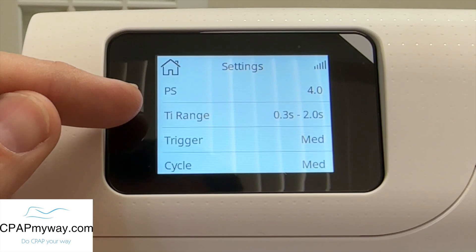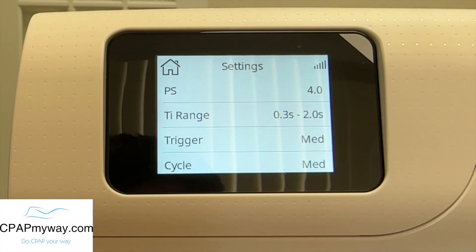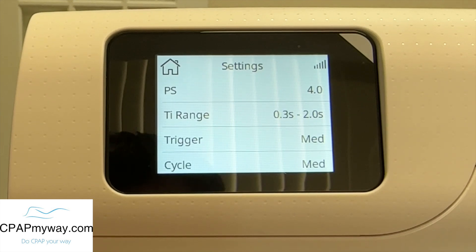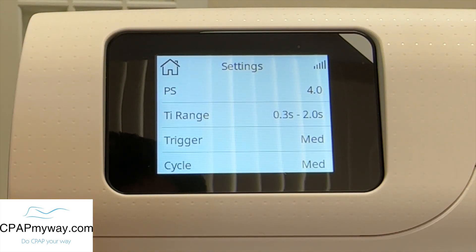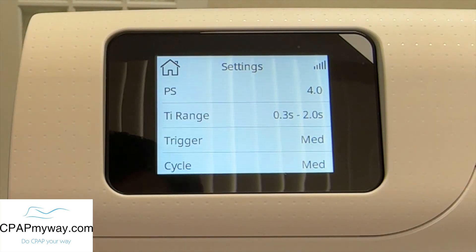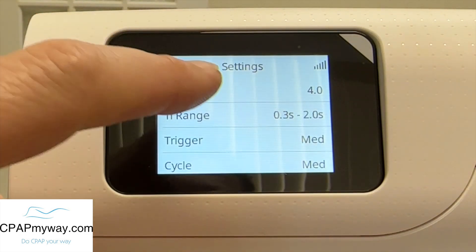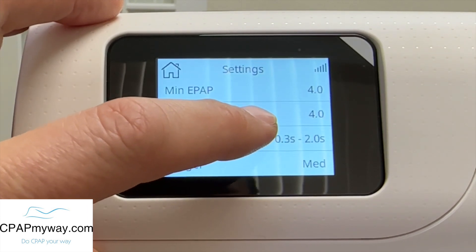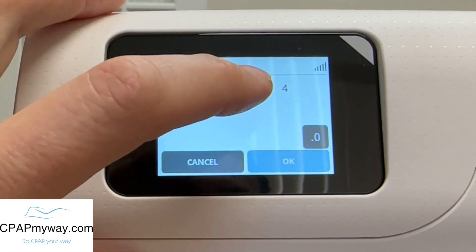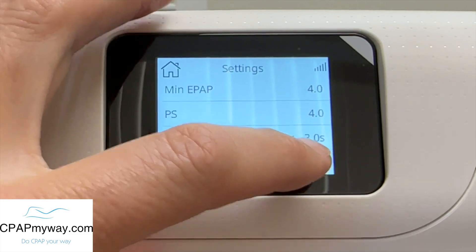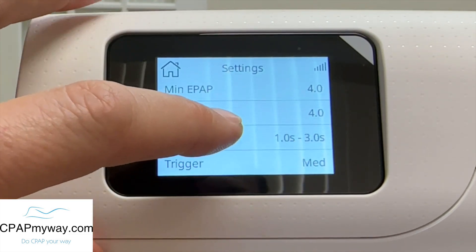The next thing you're going to see here is TI range. TI range is the range of inspiratory time limits to accommodate individual respiratory conditions. The TI max would limit the inspiration time for patients who require a longer expiration time. And the TI minimum prevents the premature cycling to EPAP for patients whose inspiratory pressure is extremely weak. It comes factory set at 0.3 seconds to two seconds. You could adjust it between one to four — so you could set a minimum of one, a max of three if you wanted to, and it would go from one to three on that.